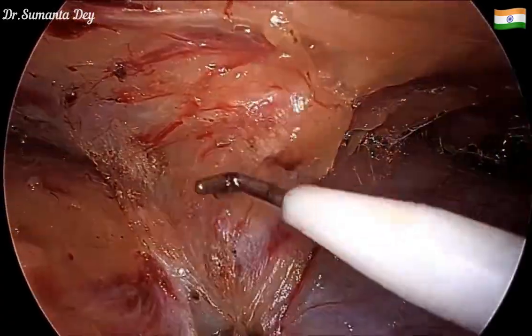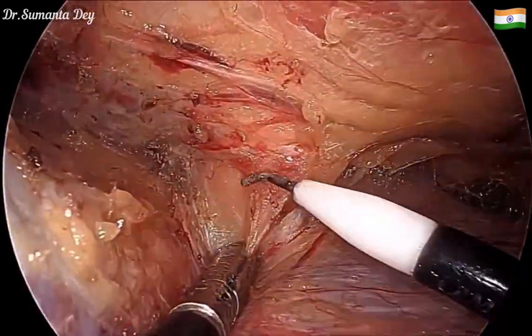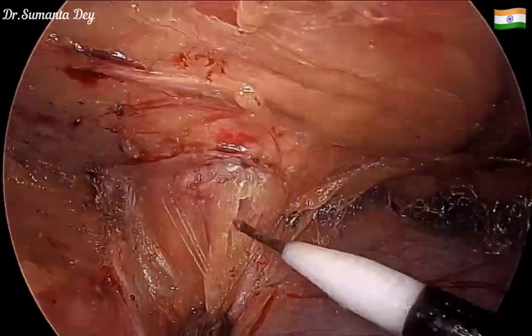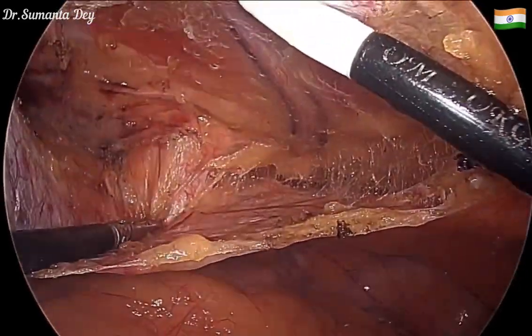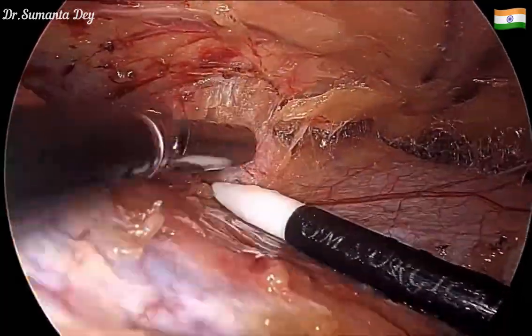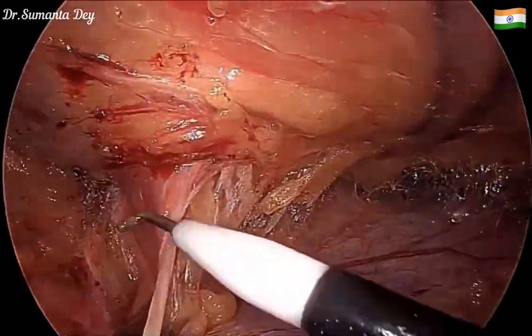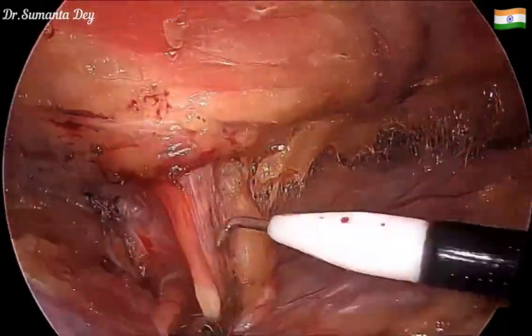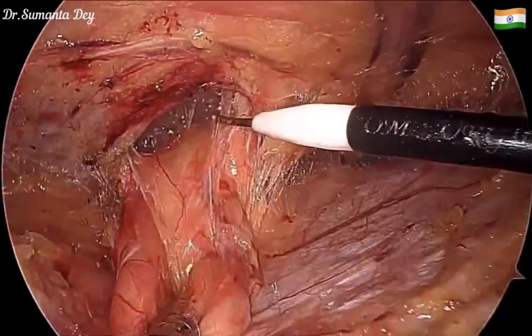Now I'm identifying the plane of the hernia sac and the defect margin. Traction and countertraction is very important here — I'm asking my scrub nurse to apply pressure from outside, while using gradual traction with the left-hand instrument and a swiping movement with the back of the hook to release the attachments of the hernia sac.